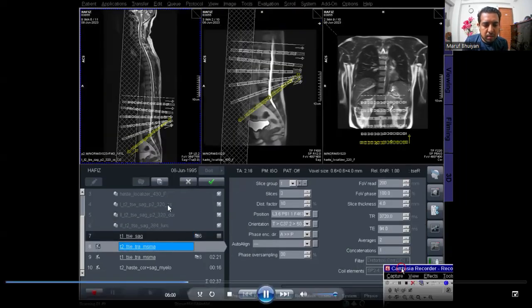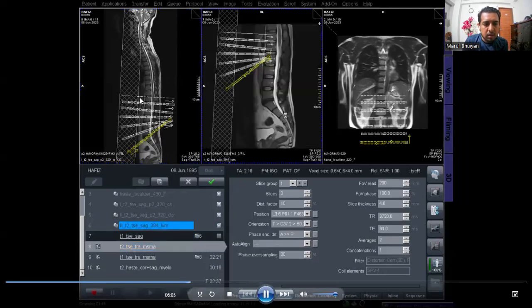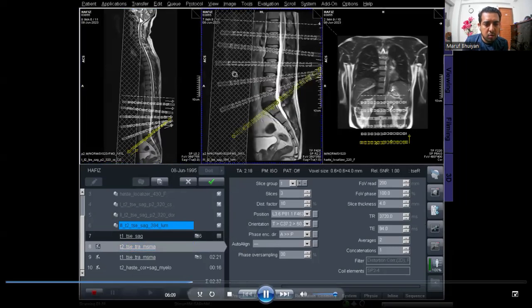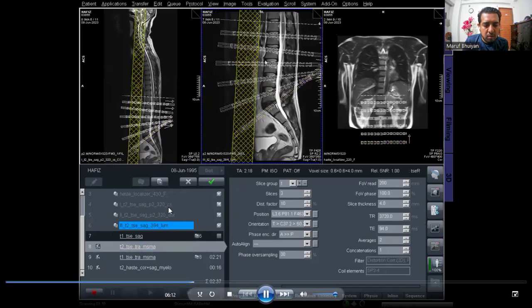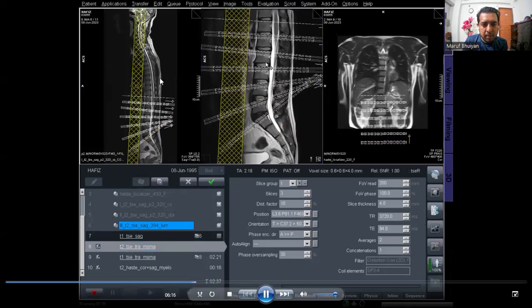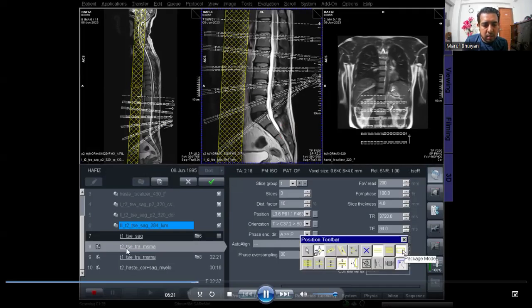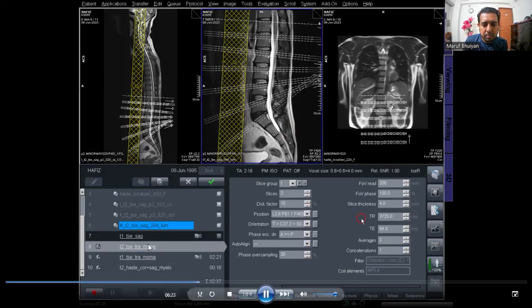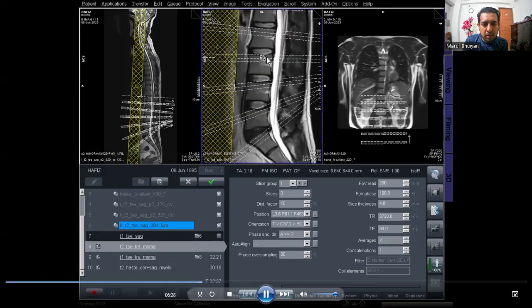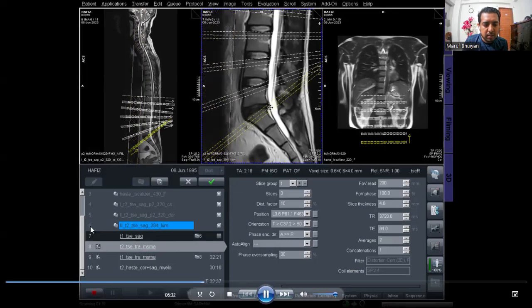Because all the cervical, dorsal, and lumbar protocols have completed, the software automatically composes these three protocols and gives us a whole spine image automatically.